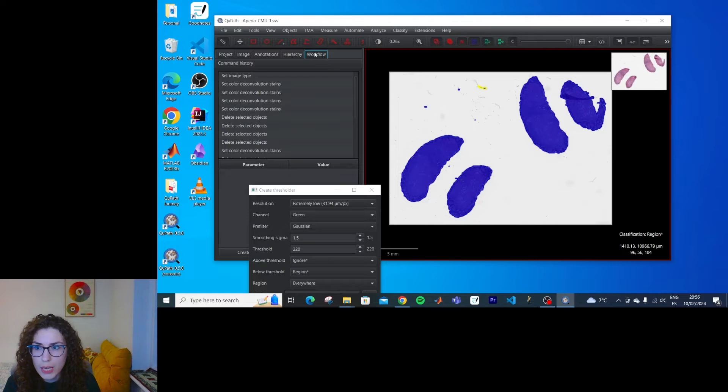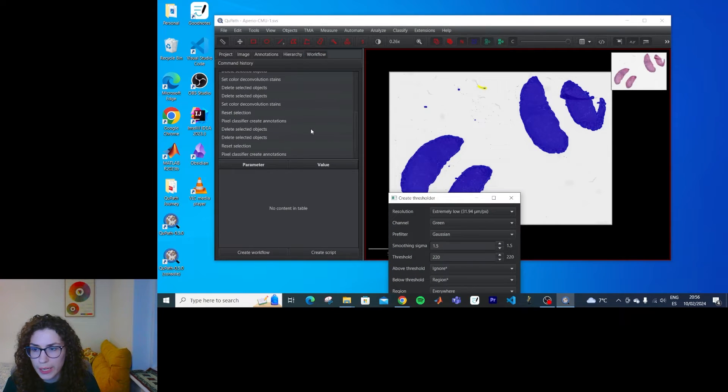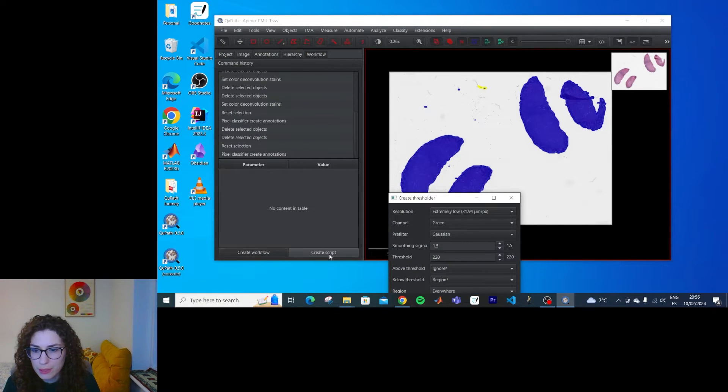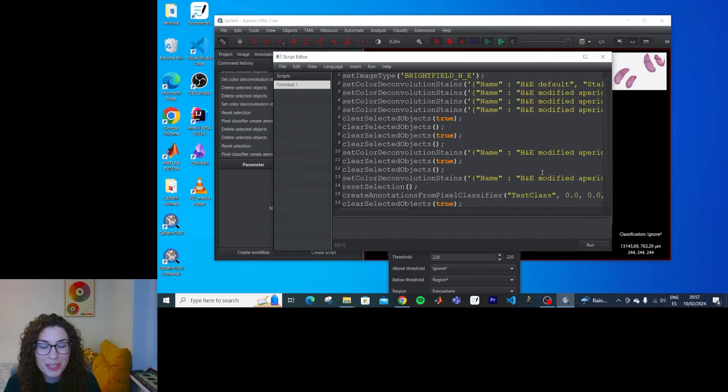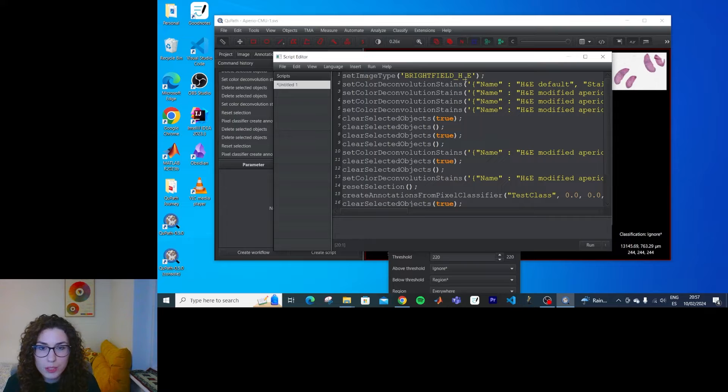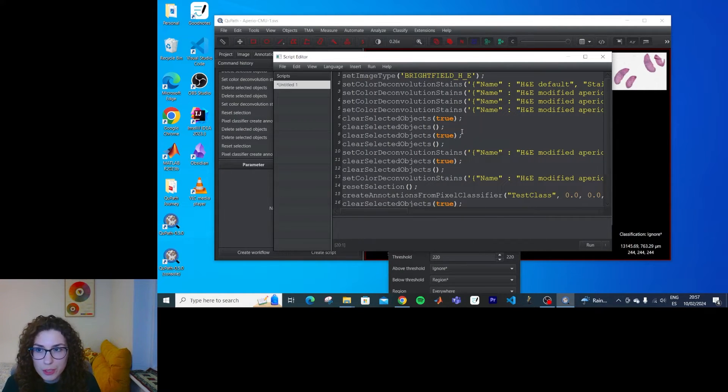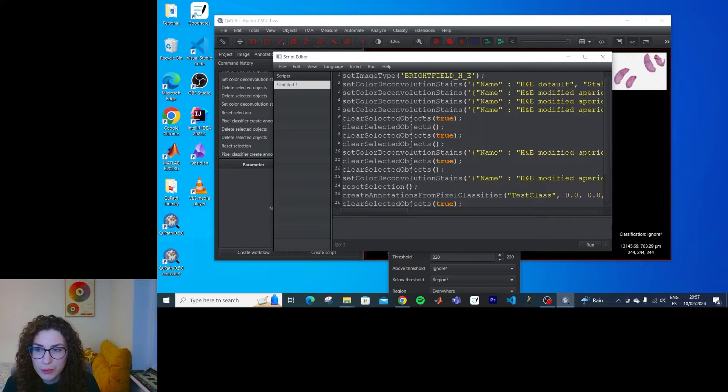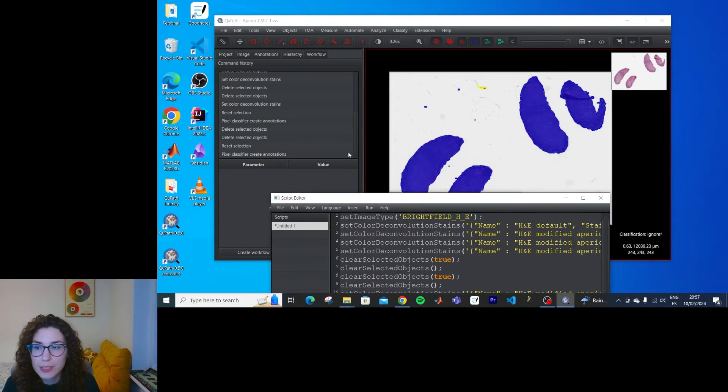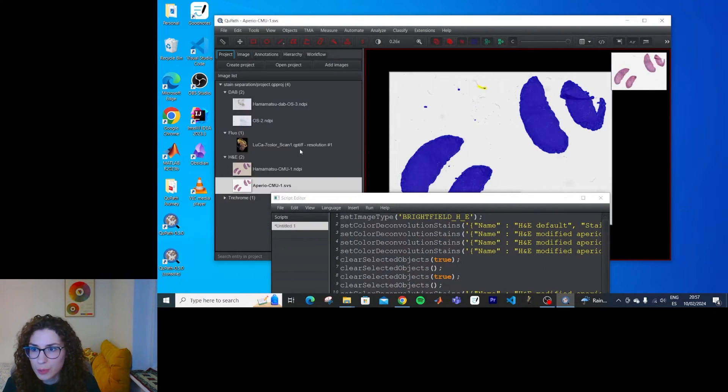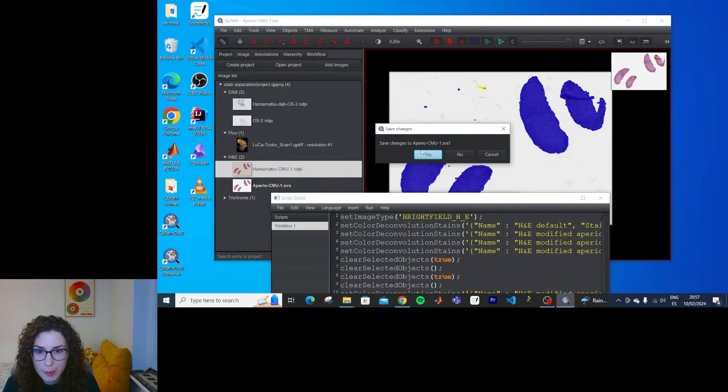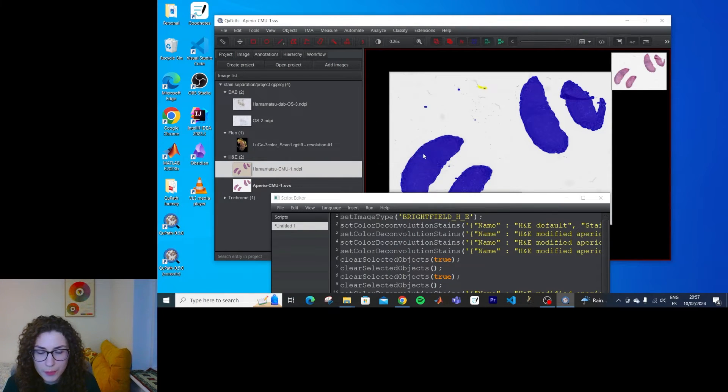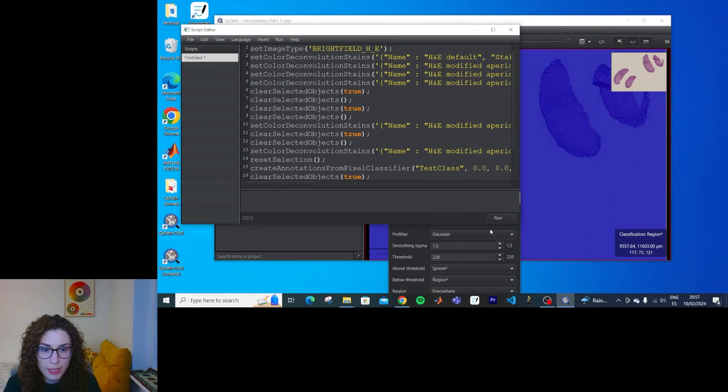Well, now I have a workflow here and I can create a script. Okay, so we will learn more about scripting further on, but I really want to use this to try and do the same thing on the other image that has a very different colour appearance and see if the results are the same. So I'm going to open the HammerMapsle and click run.